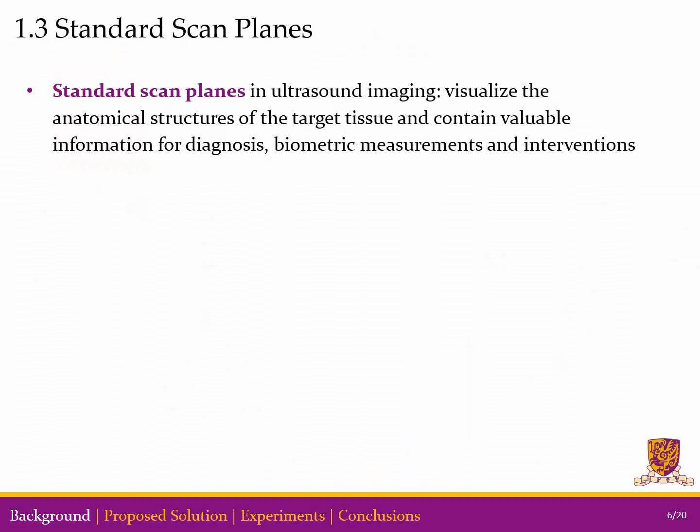The standard scan planes in ultrasound examinations are the important imaging planes defined by expert consensus to visualize the anatomical structures of the target tissue. These planes usually contain valuable information for diagnosis, biometric measurements, and ultrasound-guided interventions.